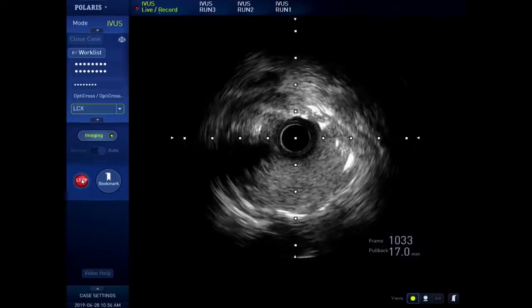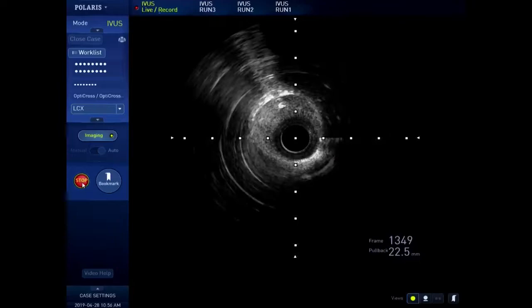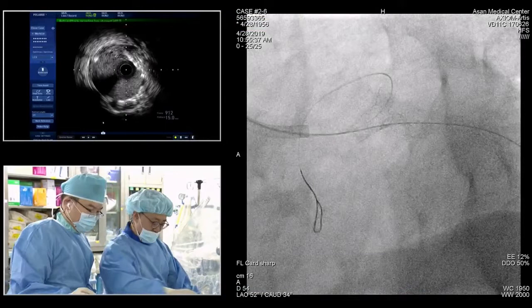You can see the circ ostium is wide open, and then we're going to recheck from the LAD to the left main and measure that ostium. Definitely this is sufficient, and we achieve the 5, 6, 7, 8 rule for distal left main bifurcation.